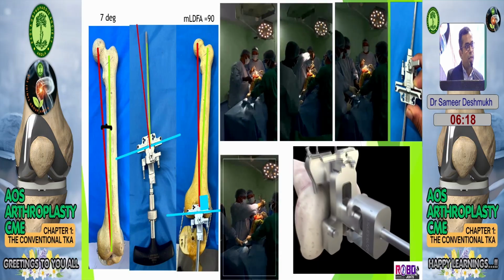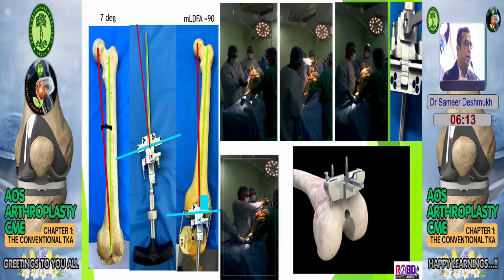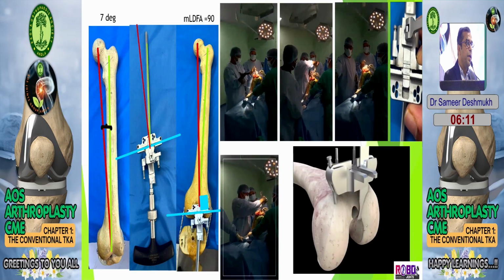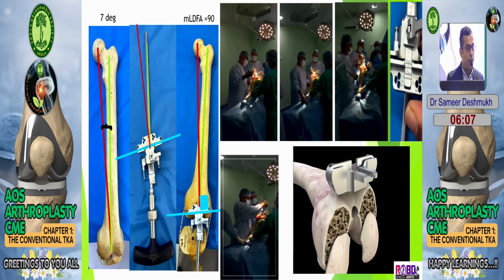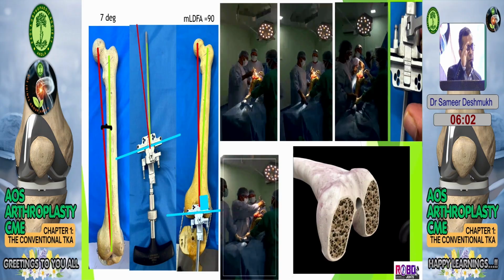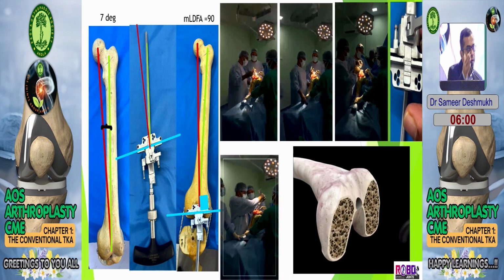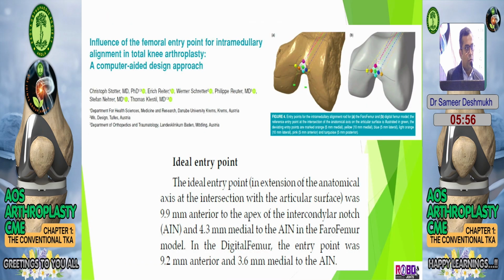And then I remove the jig and take the distal cut. So now the plane of this femoral distal cut is perpendicular to the mechanical axis of the femur and not the anatomical axis, and that is what we want to achieve. So now I have brought the limb on the femur side into one mechanical line, that is the weight-bearing axis. For the femoral entry, this is a very good paper on where the femoral entry should be.